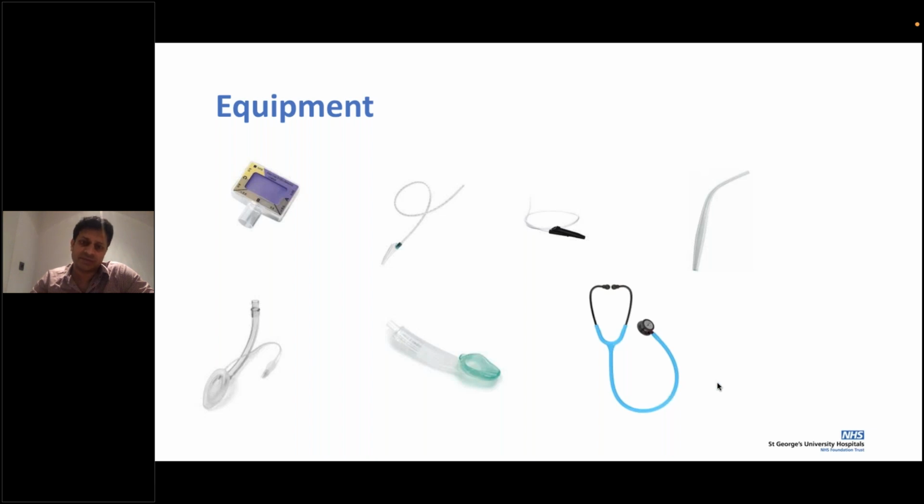A stethoscope at all points is absolutely essential, because for any intervention you do in neonatal resuscitation, the first response you get is an increase in your heart rate. So if your ET tube is in the right place, you will see automatic improvement in heart rate, followed by your saturation. Of course, you're looking at other parameters to see whether your endotracheal tube is in the right place, and I'll come to that in a couple of slides later on.